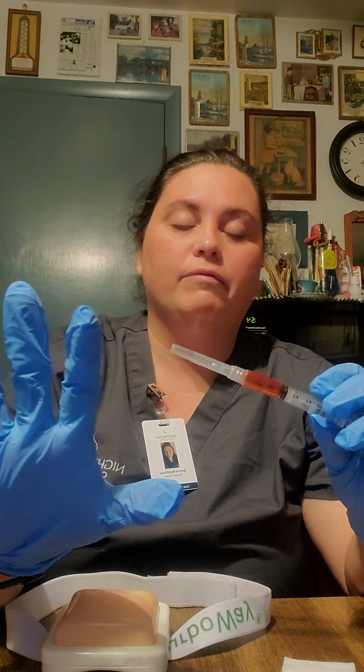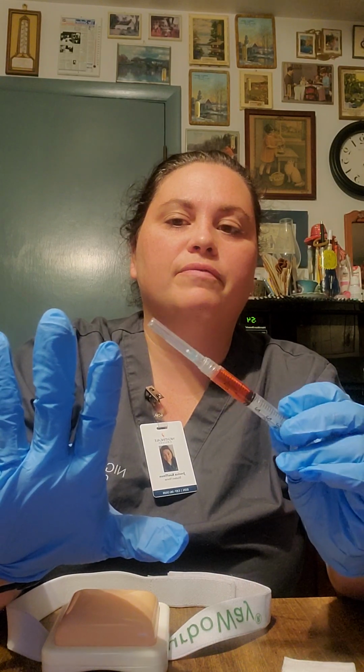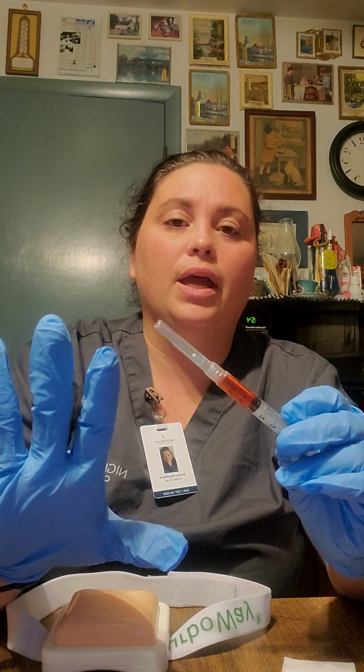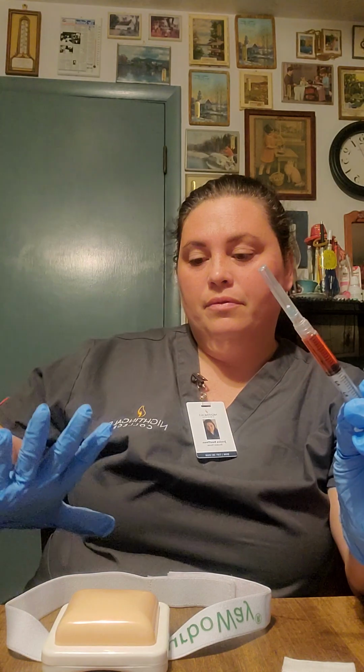Okay, so the location that my patient has chosen, I would do for placement, thumb towards the groin, index finger to the iliac spine, and on the thigh, so which would be this area here.